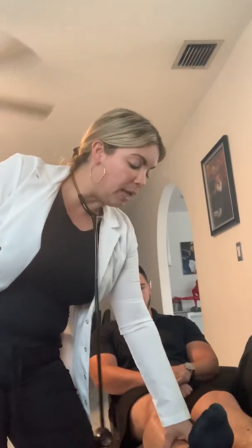Then I'm gonna do the same in the ankle. I'm gonna take the blood pressure of the ankle with the Doppler 2 times, and I'm gonna have the 2 systolic values divided by 2. And then I'm gonna do the same on the left. I'm gonna take the blood pressure with the Doppler, take the 2 systolic values divided by 2, and I'm gonna have the highest value. So the highest value, I'm gonna put as the numerator. So when I divide in the equation, a normal value should be between 0.9 and 1.3.